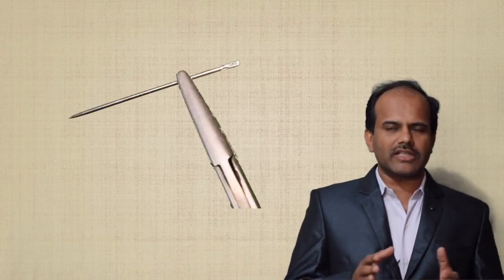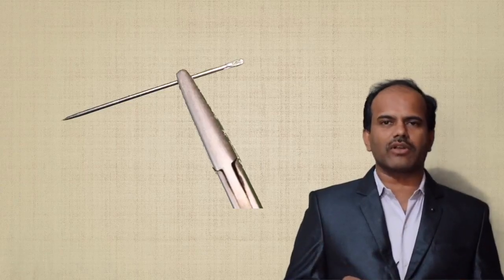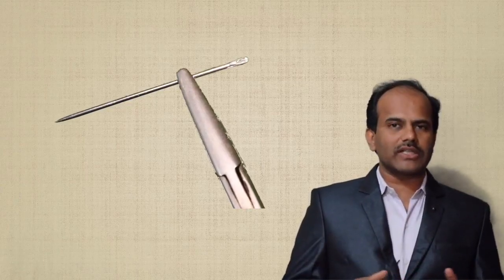First we look at what a straight needle and a curved needle are. A straight needle is just like what we use for sewing cloth. We can use the straight needle where we have sufficient space for our hand movements and instrument movements, for example for suturing the skin.